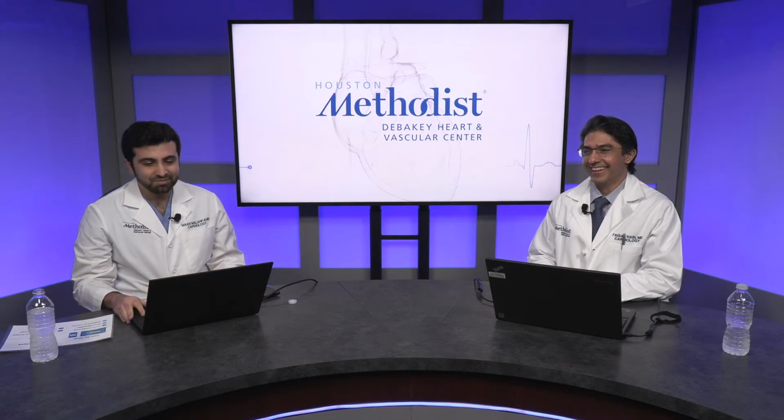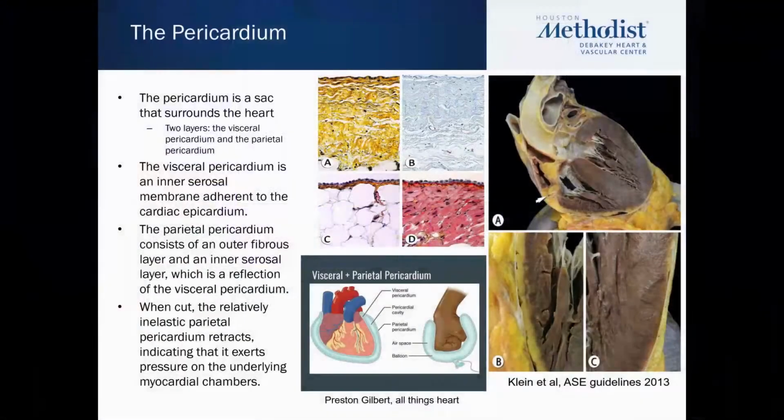So let's begin. Pericardial disease is very intriguing and very interesting. It's a lot more common than thought, and that is potentially because it's underdiagnosed. Some of the pericardial conditions are very common and some are less common, but the most important portion of this is a very careful history and evaluation, and then from the echocardiographer standpoint, a very careful exam in terms of performance, and then a very careful interpretation.